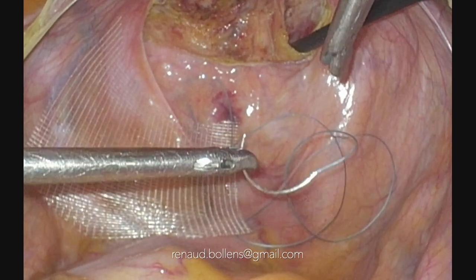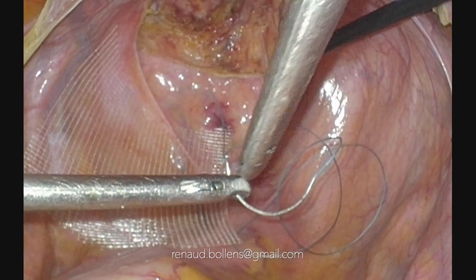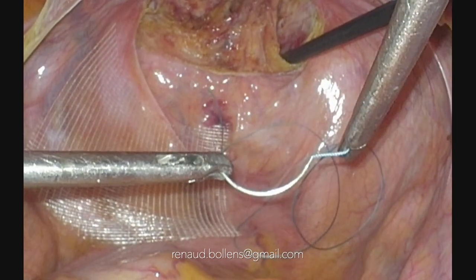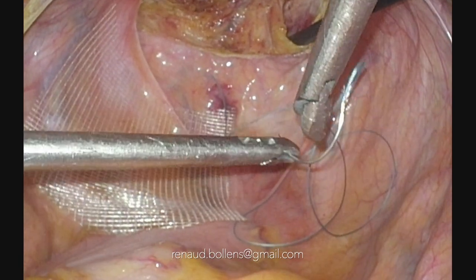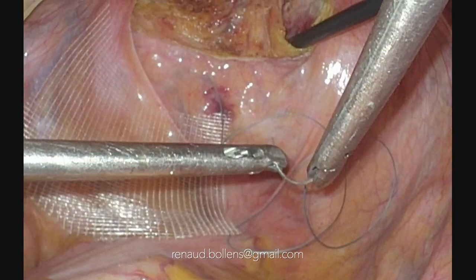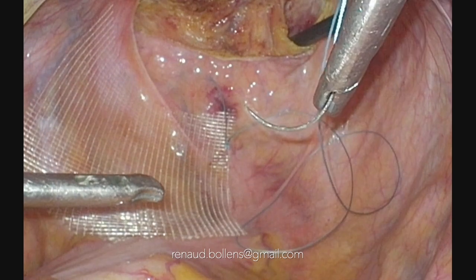Okay? To manipulate the needle, you catch the side of the tip of the needle, with traction on the suture, to place more or less the needle as you want. And after, you just add a small rotation on the left side to present the needle to catch it in the perfect shape. 2/3, 1/3, forehand, 45 degrees.